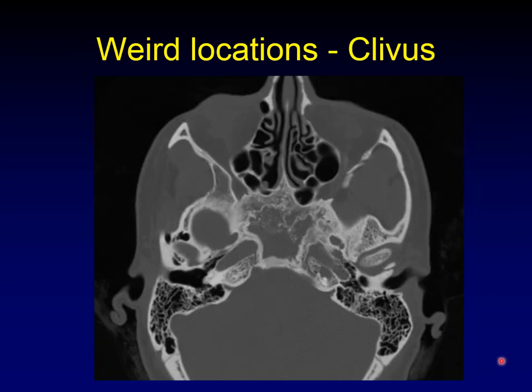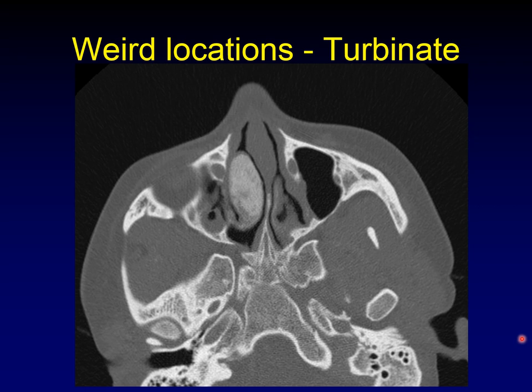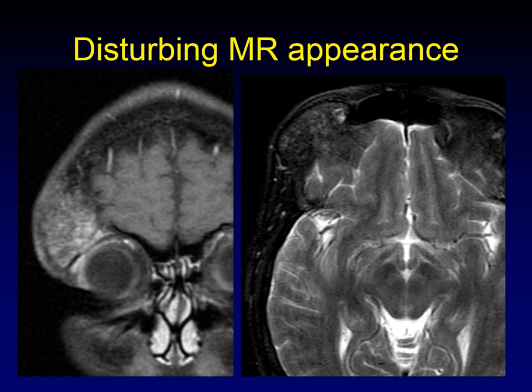Fibrous dysplasia famously occurs in the mid-face, but it can really occur anywhere. Here's an example of the pagetoid form of fibrous dysplasia occurring within the clivus, and another example occurring within one of the turbinates. Despite having a benign CT appearance, the MR appearance of fibrous dysplasia can be very disturbing and easily mistaken for a tumor — there is a whole separate lecture on a case trying to fool you into thinking it is something more aggressive.